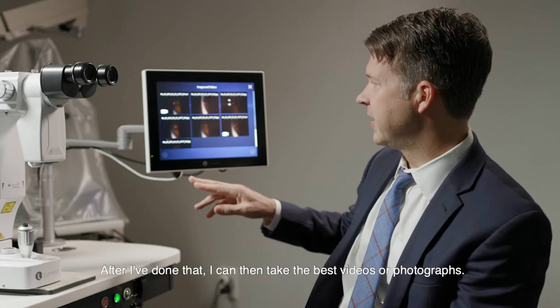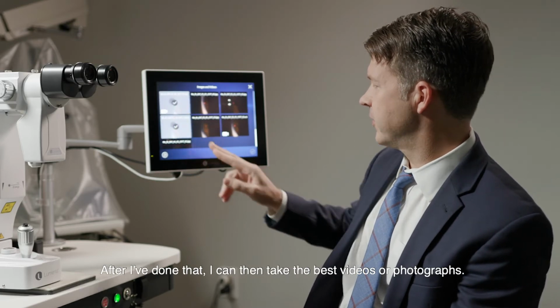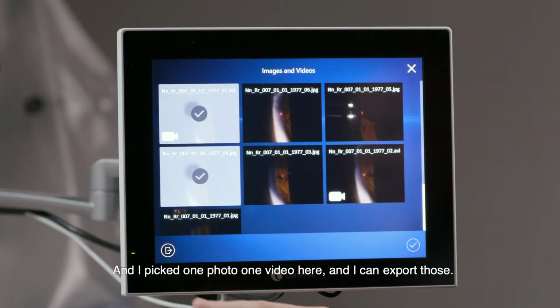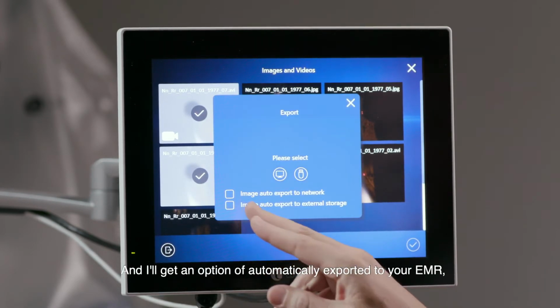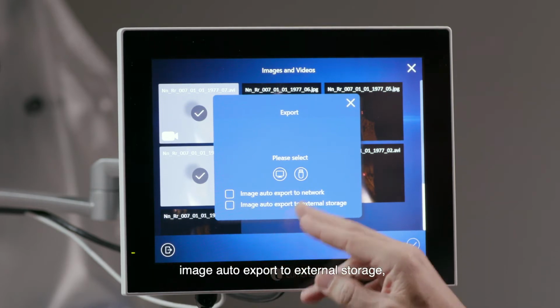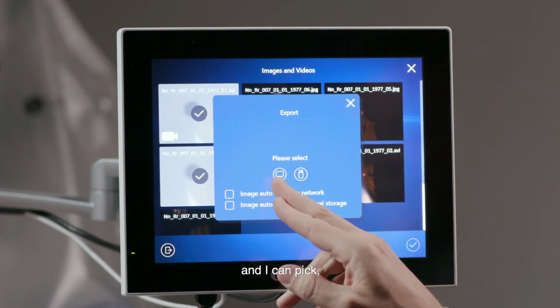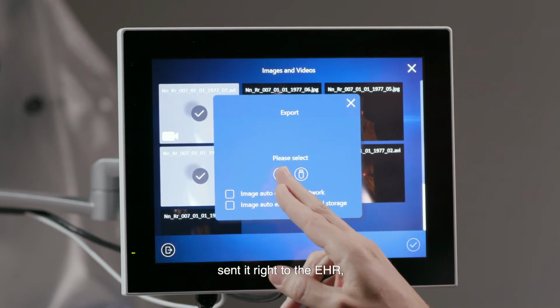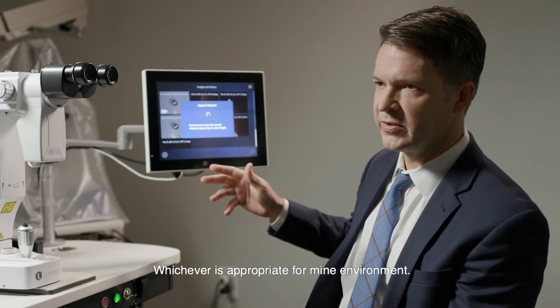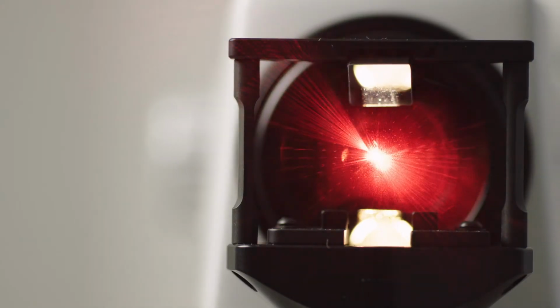After I've done that, I can then take the best videos or photographs, and I've picked one photo and one video here, and I can export those. I'll get an option of automatically exporting to your EMR, image auto export to external storage, and I can pick send it right to the EHR or go to the external storage device, whichever is appropriate for my environment.